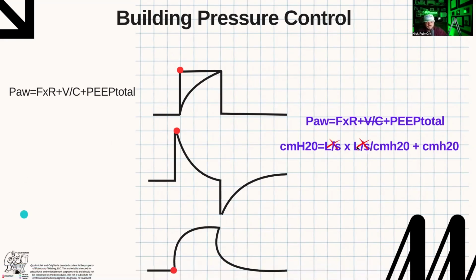So what I wanted to highlight was, the flow is directly proportional to the delta pressure you set if the patient was passive. If the PEEP was 5 and the delta pressure was 15, and the PEEP was still 5 but you made the delta pressure 10, there would be less flow because there's less of a gradient. Similarly, if the delta pressure was 15 and I made it 25, then your flow should go up because there's a higher gradient.